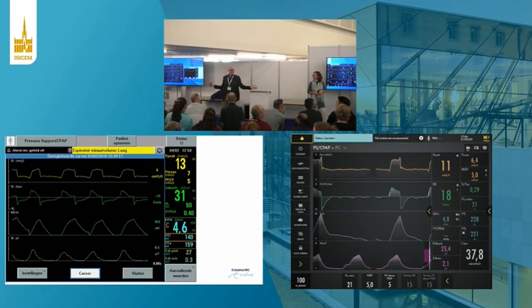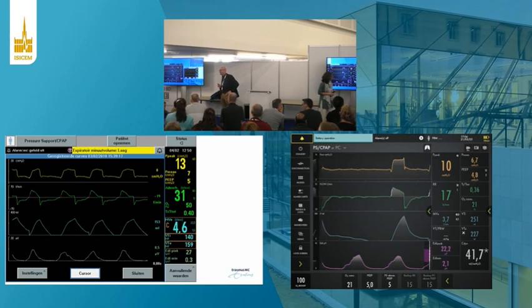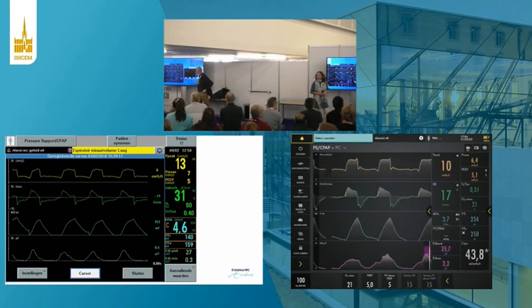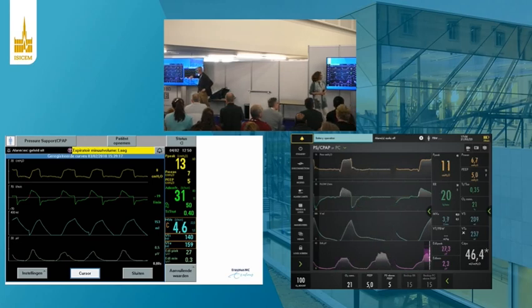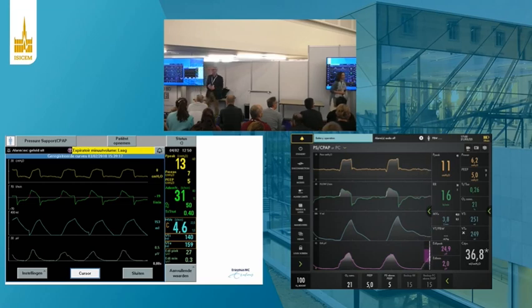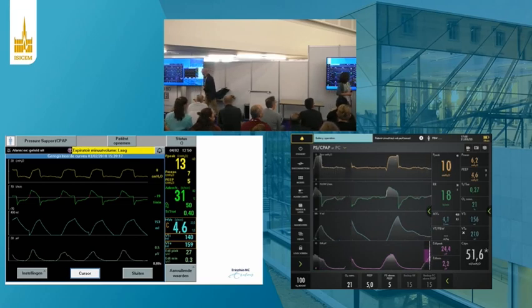First, in the end of inspiratory pressure support, you have a peak. It's indicated too early, expiratory. No, in a pressure support, you have a... We're discussing this screen. I'm sorry, we're not discussing the ventilator screen, we're discussing slides. Here. Air trapping. Focus on this breath. Pressure support.